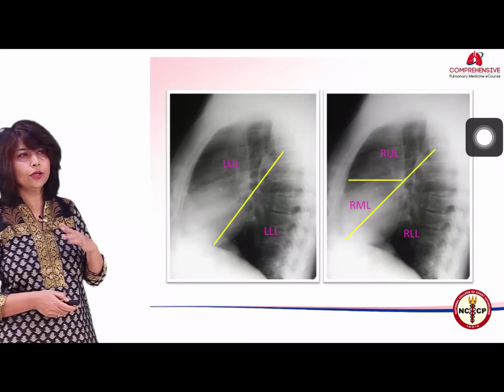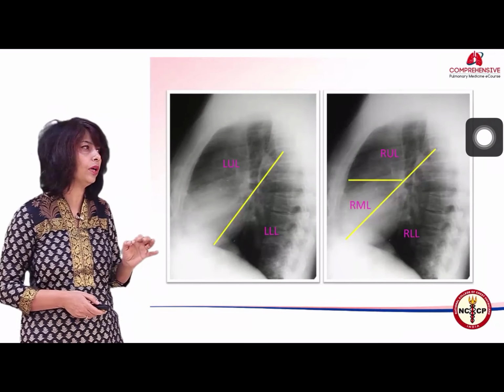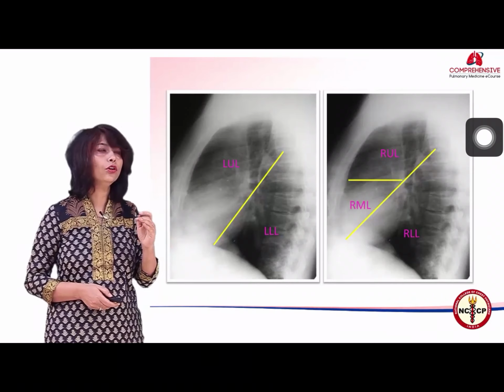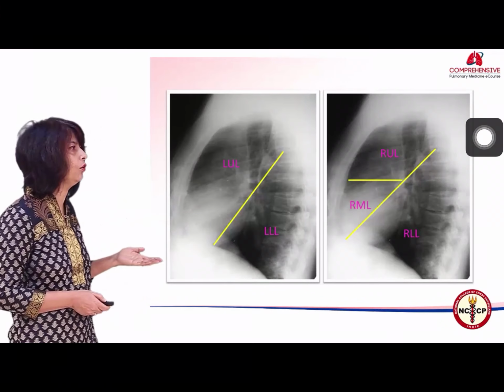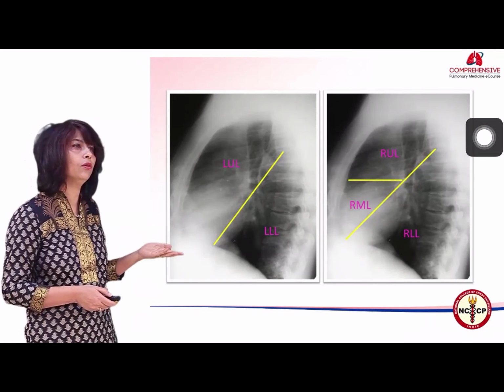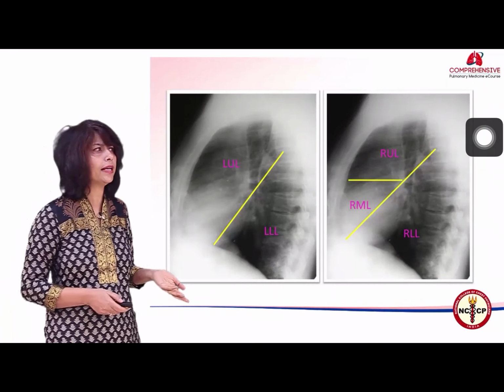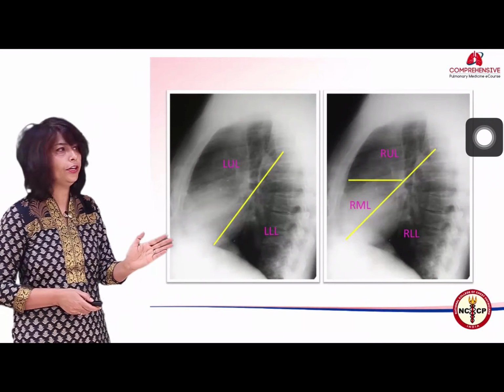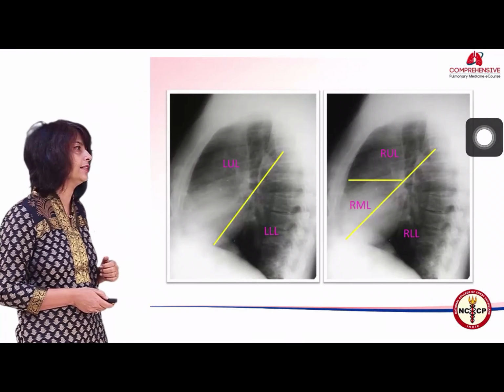If you ask, in today's time of CT scan, what is the use of supplementary views? I would say whenever you are not going in for a further CT scan, do a lateral radiograph. For instance, you have an upper lobe consolidation, maybe you want to do a BAL and you want to see what the organism is, you want to know quickly whether it is upper lobe or middle lobe. You don't want to do a CT scan simply to localize the pathology. It's good to add on a lateral radiograph. With very little radiation, you will get more exact localization.